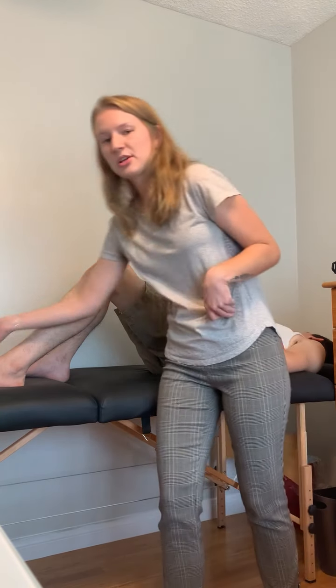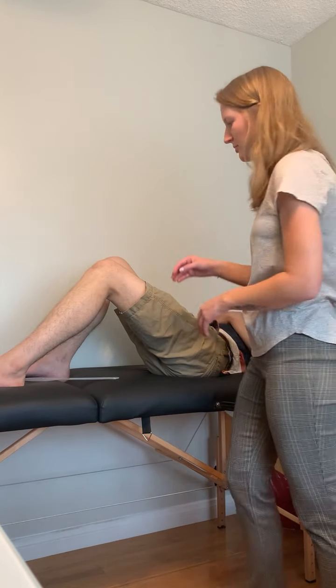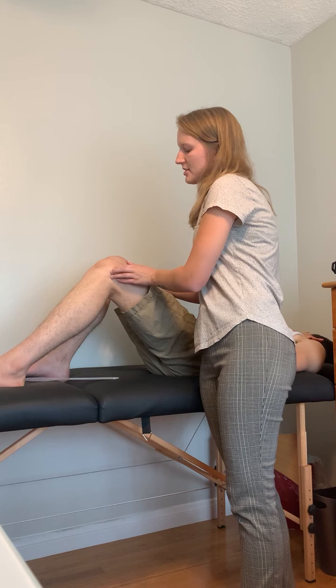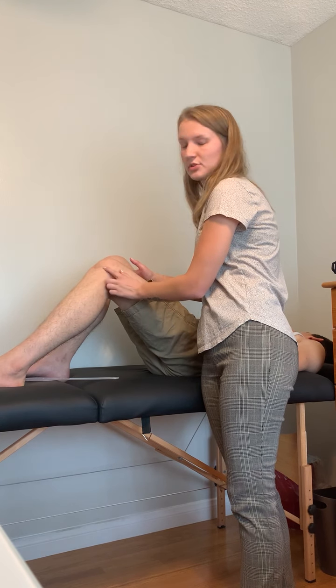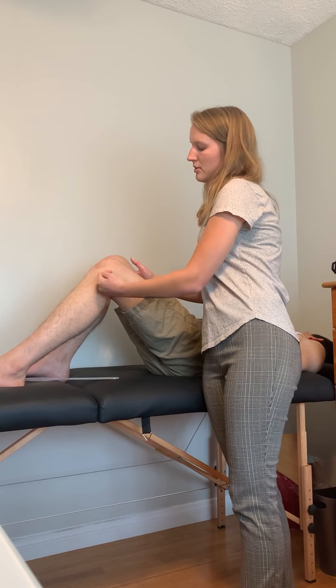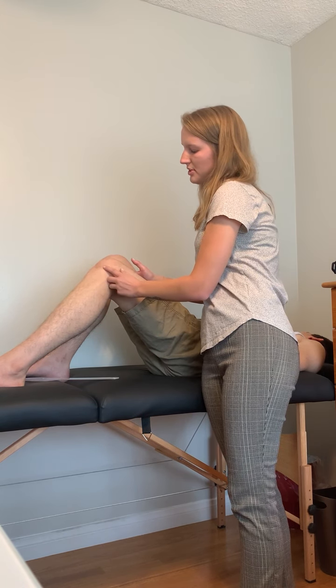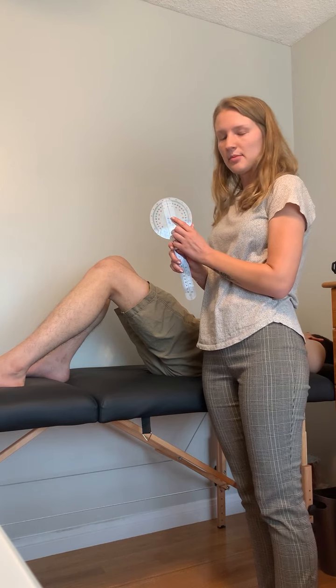We'll be measuring for knee flexion, which is how much the knee is able to bend on its own. So first, like I mentioned, we're going to find that joint line between the tibia and the femur. We're going to go right to the side of the knee here, and we should be able to feel a space between the tibia and the femur. If you move your finger up, you'll be able to feel the lateral epicondyle of the femur. That's going to line up with the axis of our goniometer.